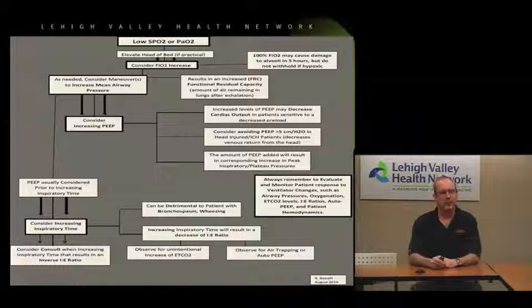Now, if it's simply an increase in end tidal, but their saturations come up to an acceptable level, maybe we're willing to trade that off for the short term, just to keep the oxygen flowing throughout their body and maybe live with a little bit higher CO2. Now, if there's signs of air trapping or auto PEEP, you see their auto PEEP levels rising, like let's say you have it set to 5 and you notice it won't go below 10 when you're looking at your ventilator, then maybe you need to take a look at what you're doing, and maybe you need to turn your I time back down. You need to see what you're willing to trade off to get your oxygenation.